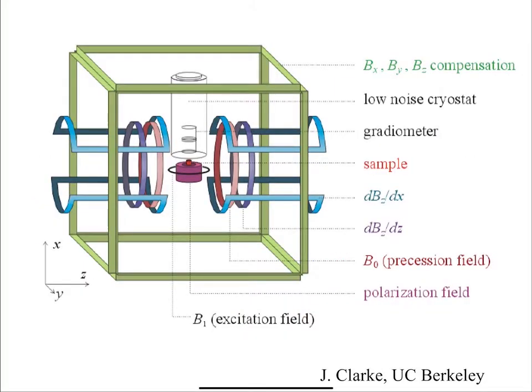So this is some work done up at Berkeley, where basically they have a very small permanent magnet there. Okay, so just a little magnet there, which is creating some field, a little higher, probably about 20 times the Earth's magnetic field, so like 60 microtesla or something like that, or maybe 300 microtesla, I think, is what it was.